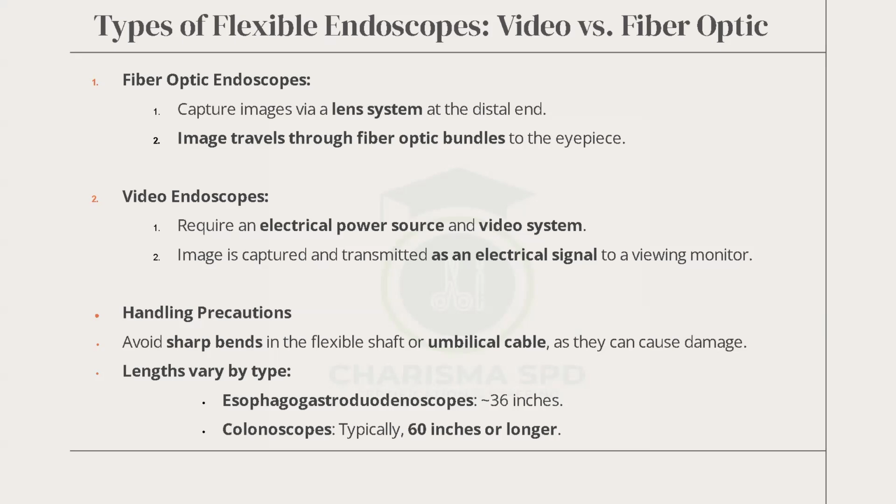All right, how do we treat that? Whether fiber optic or video scope, avoid sharp bends. I have had surgeons take pictures and send them to me complaining of how technicians have put together flexible scopes.